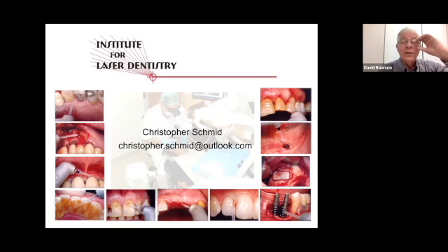Right. I think when we first connected, Chris, I got from you the thought that this was an adjunctive therapy, not necessarily aiming to eliminate or replace either CPAP or a dental appliance. And what I heard from you tonight is we're just going to expand the airway and make things more effective, perhaps lower air pressures, and not have to advance the mandible. But if you could find some evidence on that, in dollars and cents, it probably wouldn't change a lot.